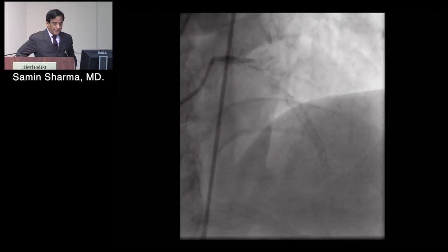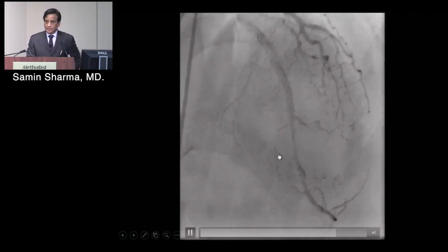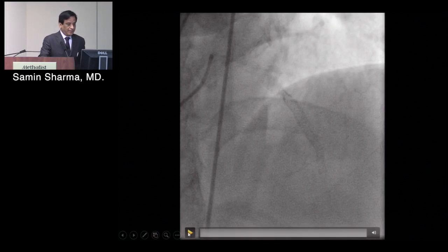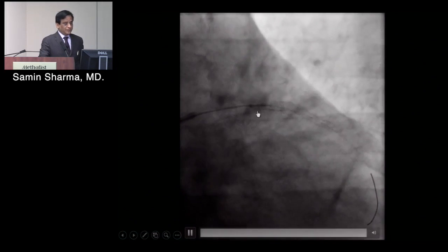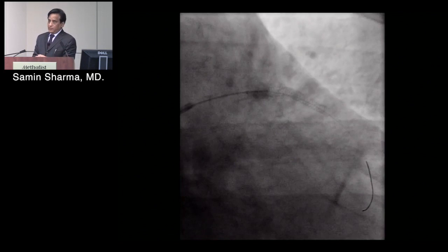So there are very limited options. What has been used in the past is a laser, vaporizing atheroma, and particularly the plaque behind this calcific that may subsequently expand. And another option is that you can use atherectomy. So this patient otherwise was okay. So first we use the orbital. We said, well, let's see whether orbital will work to expand this.